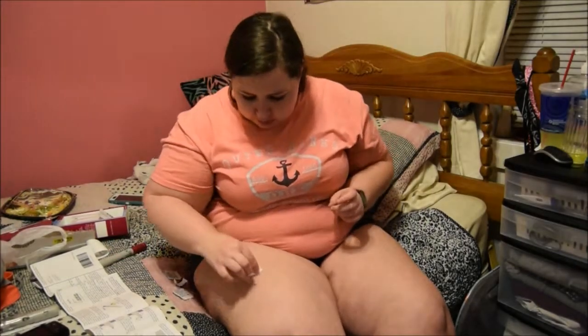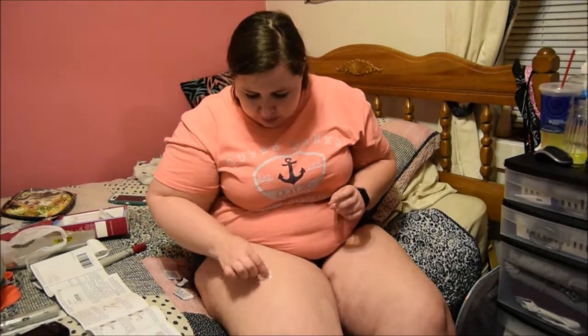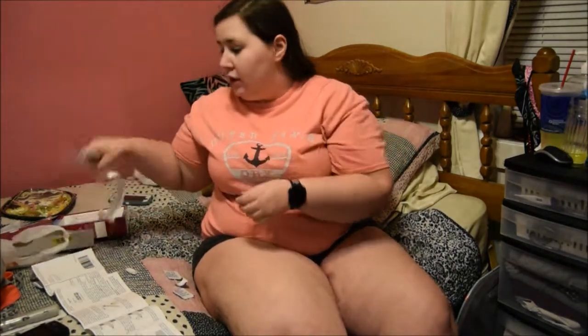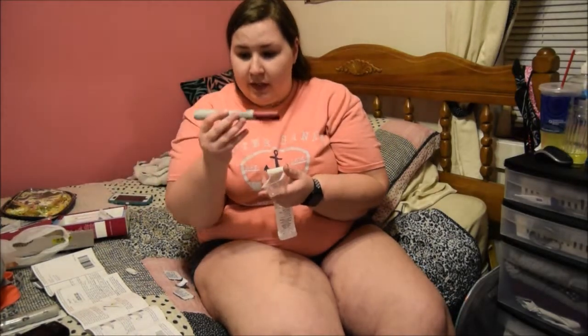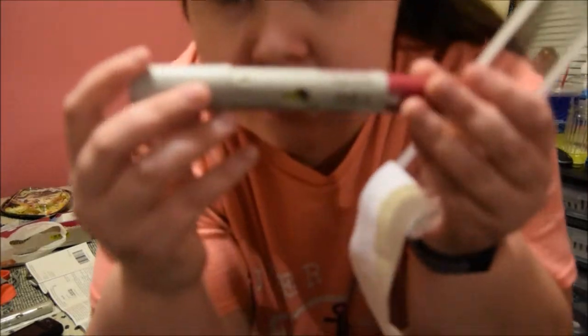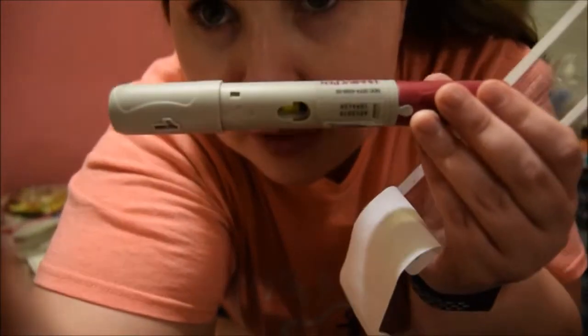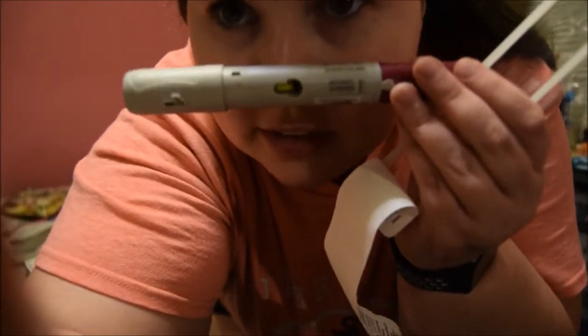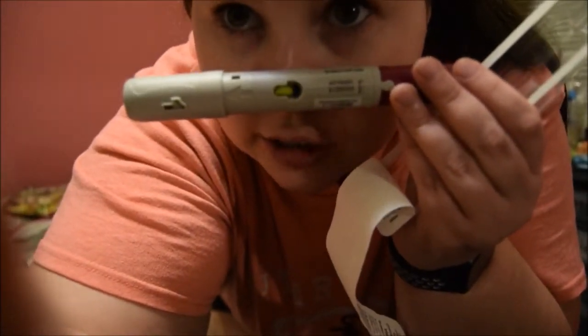There is one done. Now, I'm going to take this little alcohol swab. I'm going to clean that one off. And so this one is done. I'm going to dispose of it properly. For right now, I'm going to put it over there. And see how you see it's done. So you can see this little yellow thing right there, which means it's done. You wait 10 seconds and inject it.